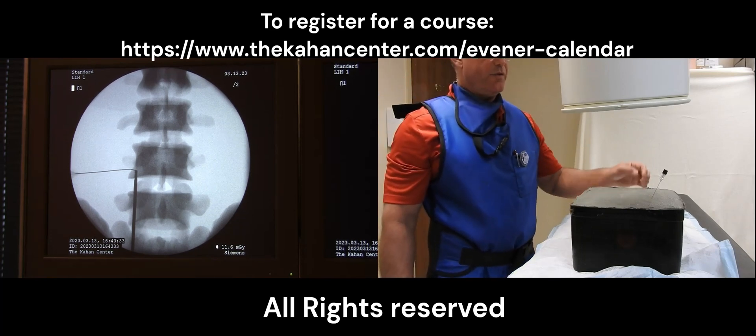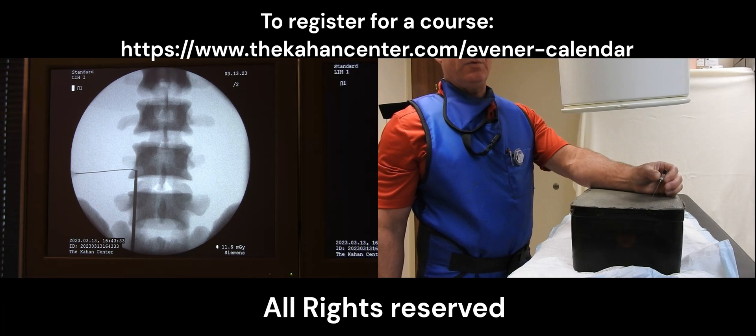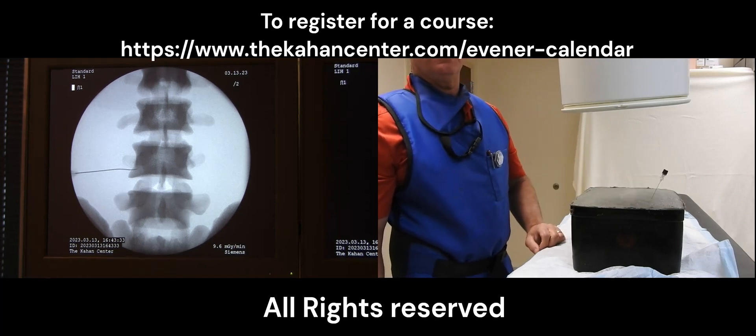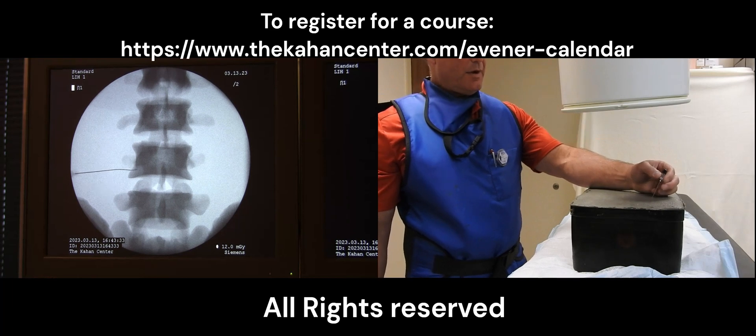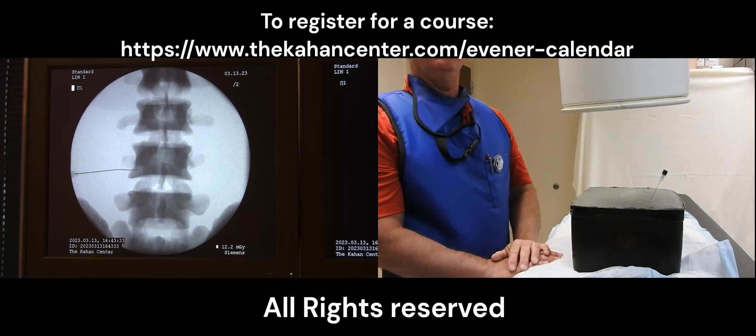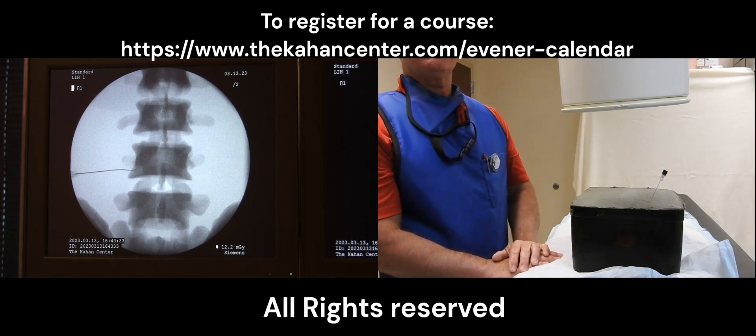I really don't have to advance it any further. What I can simply do is rotate the hub of the needle so that it's pointing upward, and once I do that you will see that we will be at the six o'clock position. I will then slightly advance it so that I am at the six o'clock position under an AP view, and this would demonstrate a successful transforaminal epidural injection.